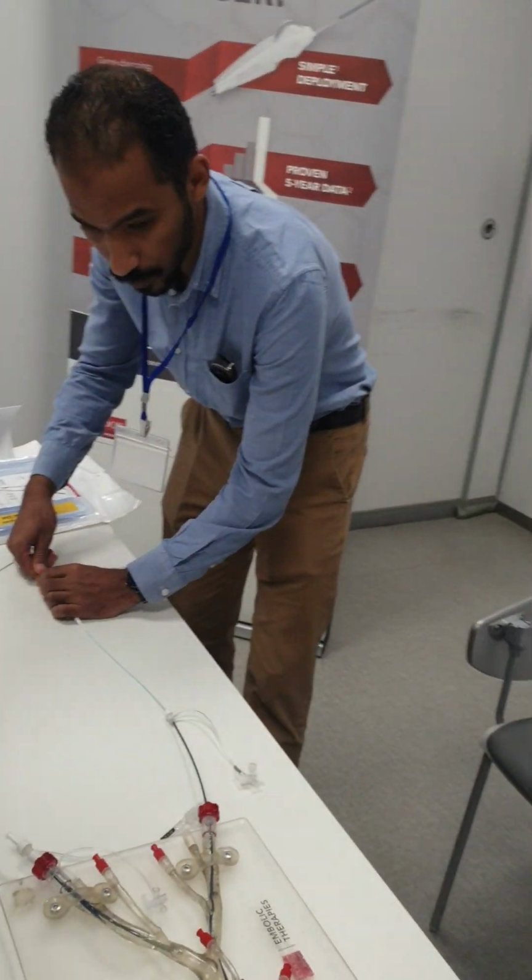And the length, it depends on the length of the vessel. You can estimate, the length is not that important. Yeah, you can use a second or third. Excellent. How many coils maximum can you use? You can use 10 coils. It depends on the length of the vessel. There is no limit.